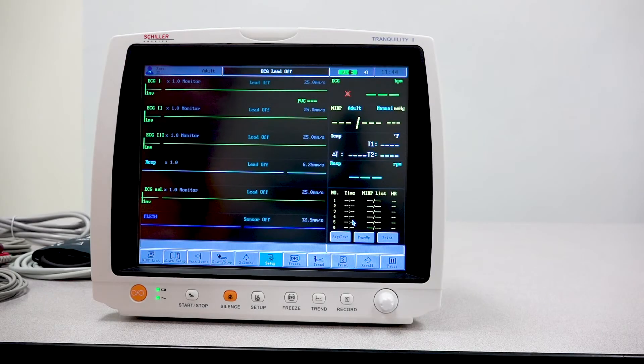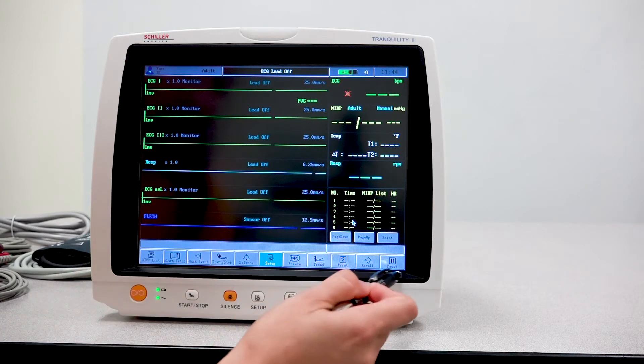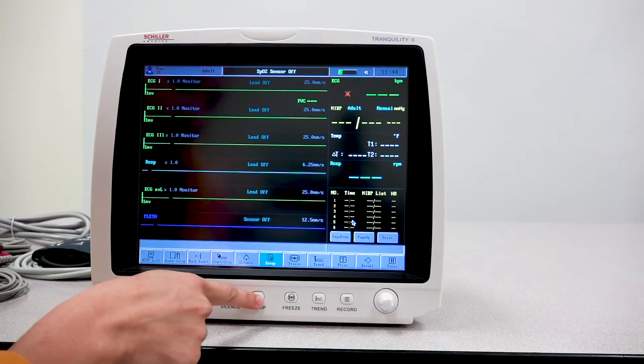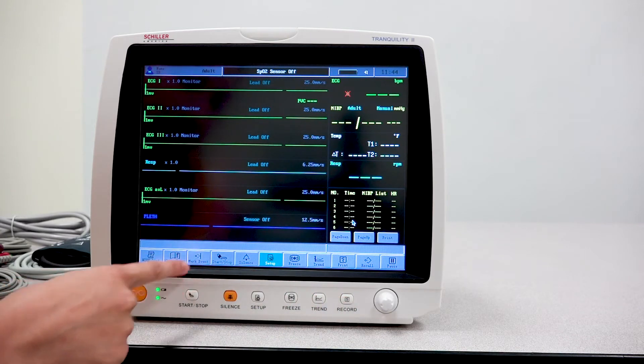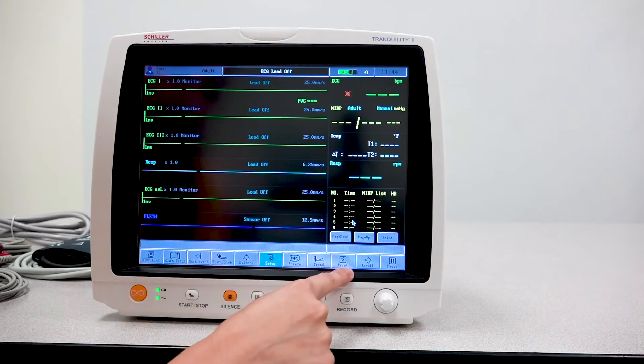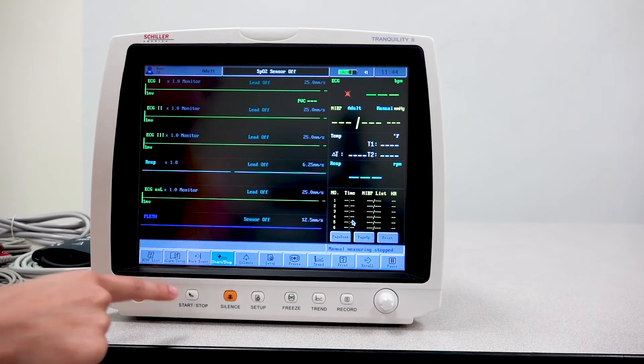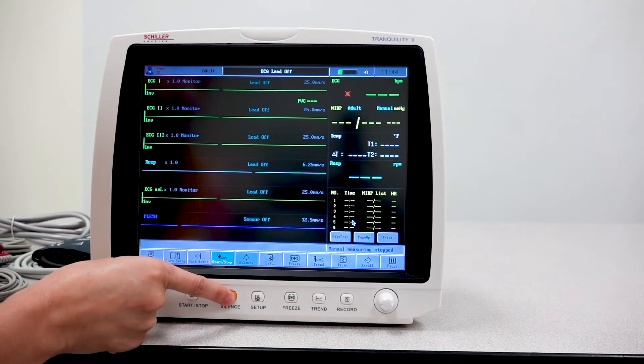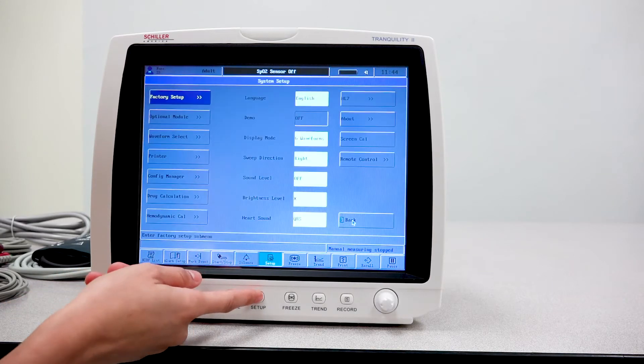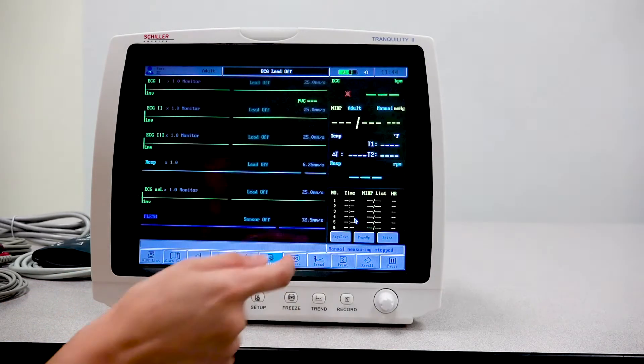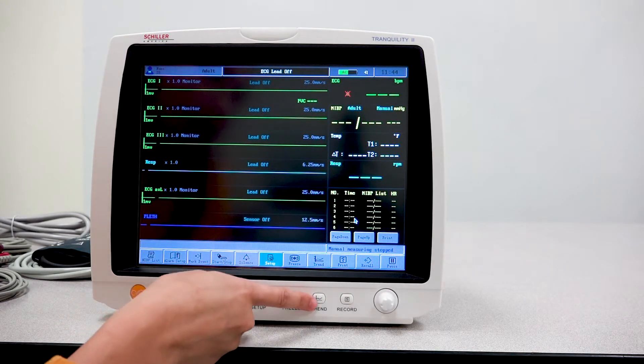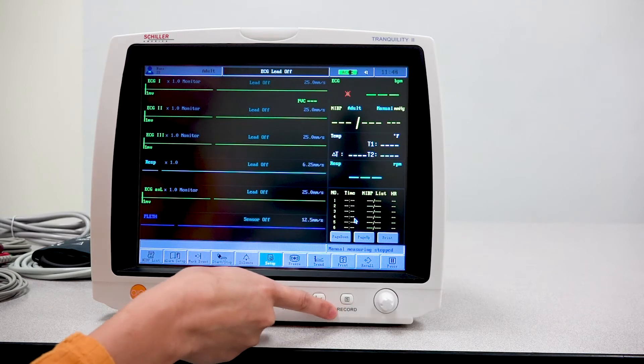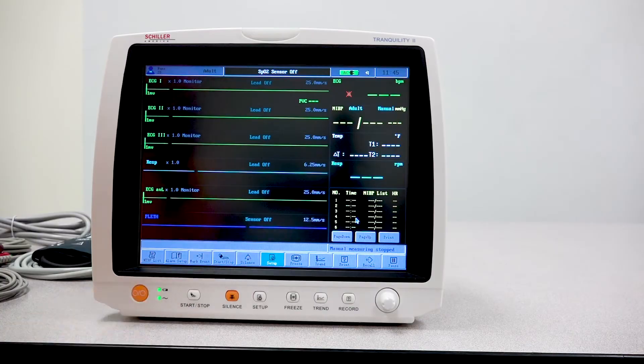You also have these buttons toward the bottom of the monitor that is quite similar to the commands here. So you have your start and stop NIBP measurement button. You have the silencing or muting button, your setup button, you're able to freeze, you have the trend and the record button. And that is actually for your printer to print out the report.